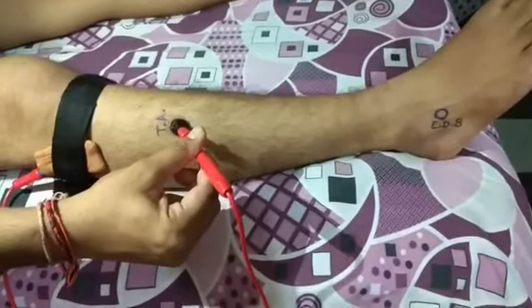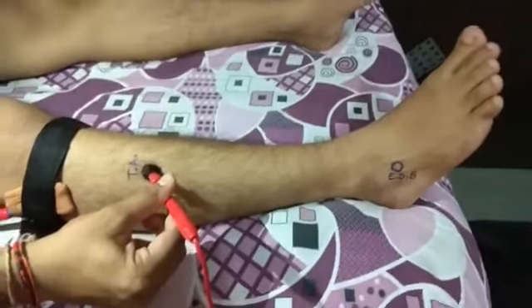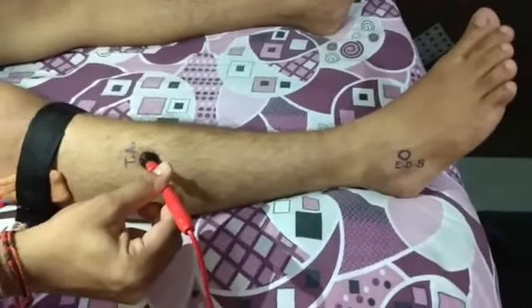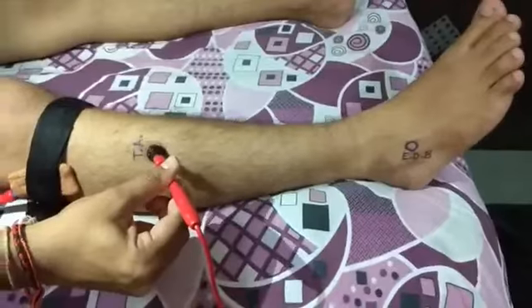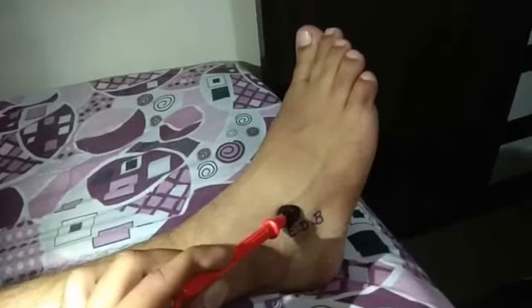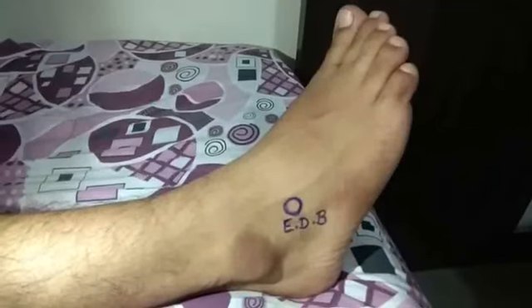The muscle tibialis anterior is supplied by the deep peroneal nerve. Action is dorsiflexion and inversion. This is the motor point for the extensor digitorum brevis. Action is extension of the digits. This is the motor point.